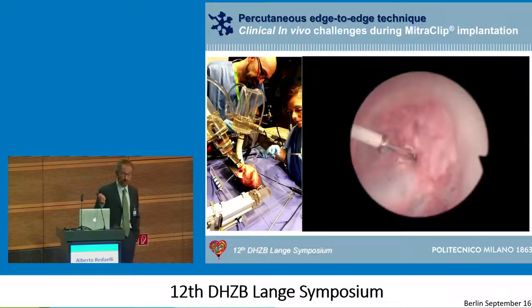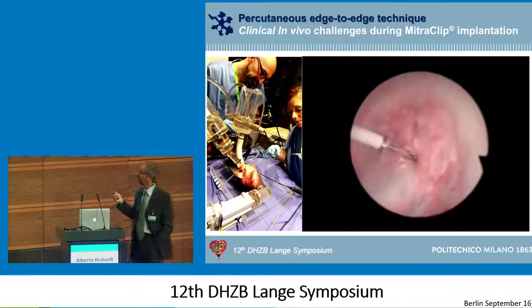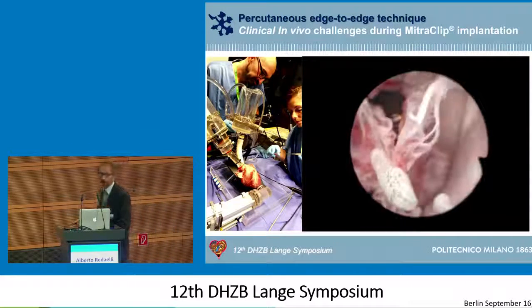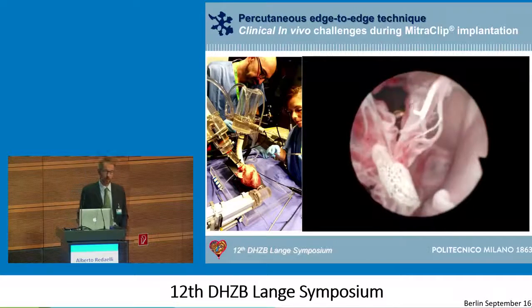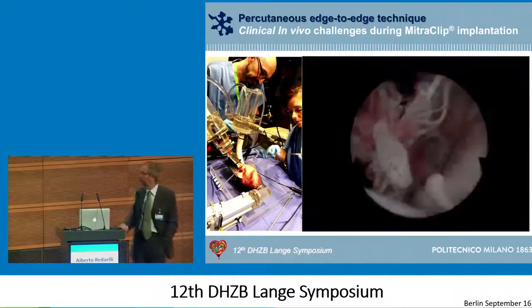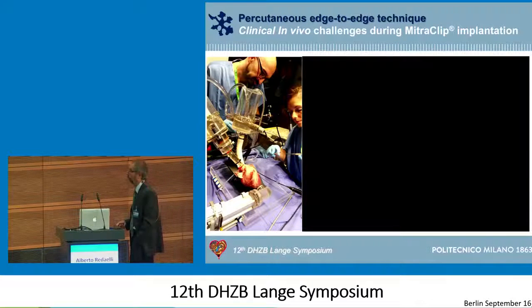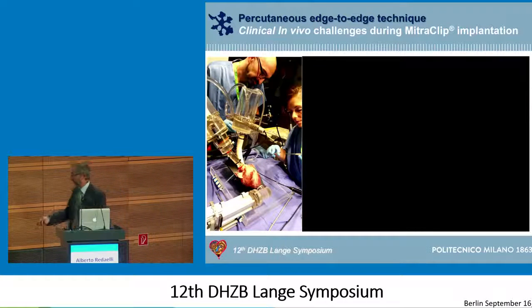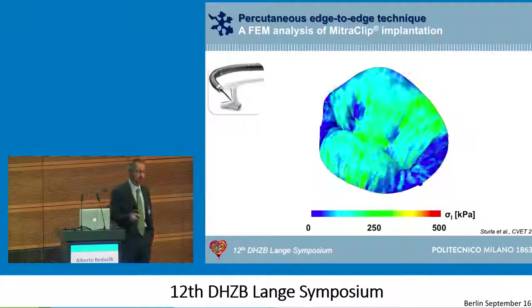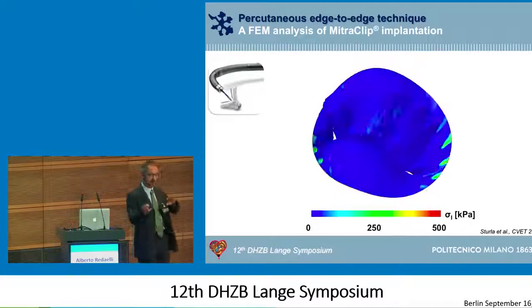This kind of imaging is useful for training, of course, and is also useful for checking new technologies and new ideas. For instance, I think it could be a good system to check the application of the melody in the mitral position, just using small hearts. But unfortunately, it is not able to give us information apart from those about fluid dynamics.